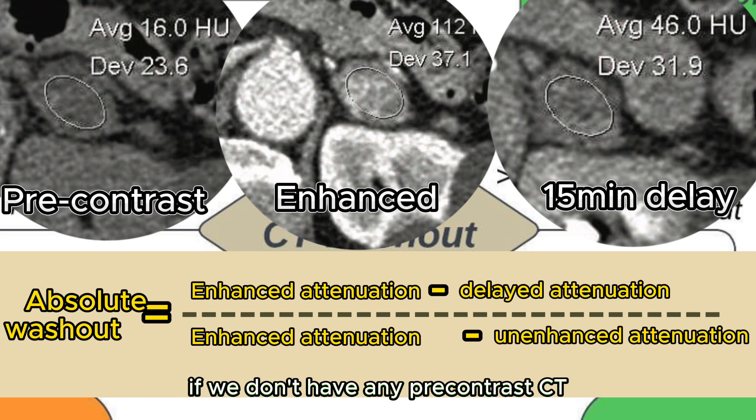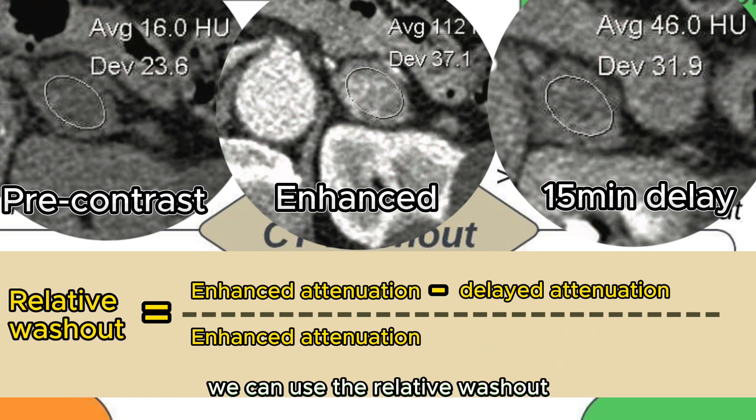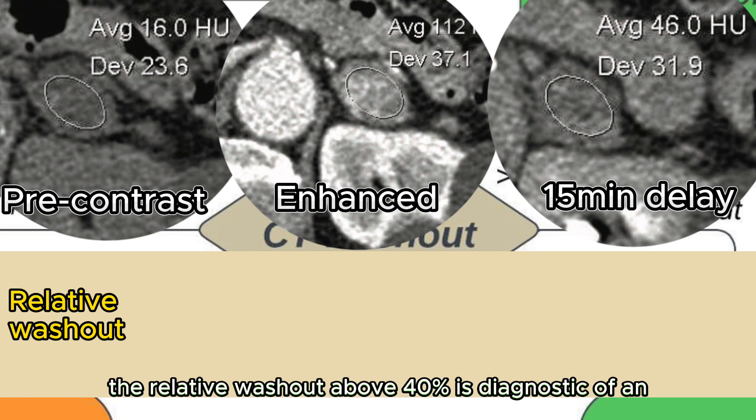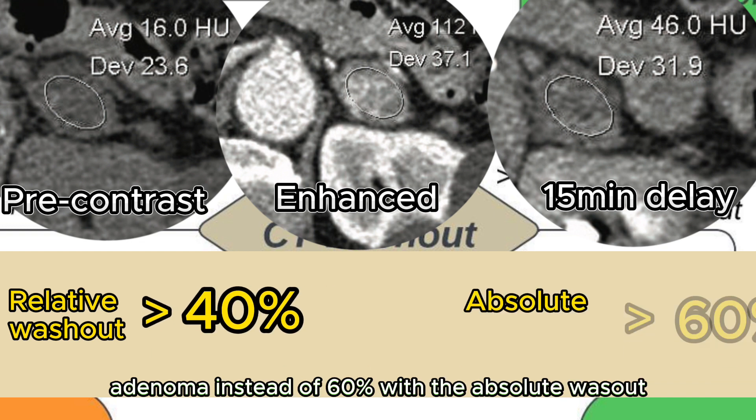If we don't have any pre-contrast CT, we can use the relative washout. And in this way, we can bypass the first step of the flowchart, as I mentioned before. And with this formula, the relative washout above 40% is diagnostic of an adenoma instead of 60% with the absolute washout.